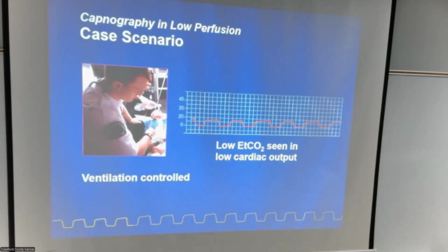Tube placement correct? Yes, you have waveform capnography. Tube placement is in. What's the last thing we want this patient to do? Well, we don't want him to stop breathing. Good point, rule number one. If he's hyperventilating, he's blowing off CO2, correct? What we want in a head injury is to blow off that CO2. We don't want him to get put down at 25, but still, what do we need to do to this guy? What's his issue?